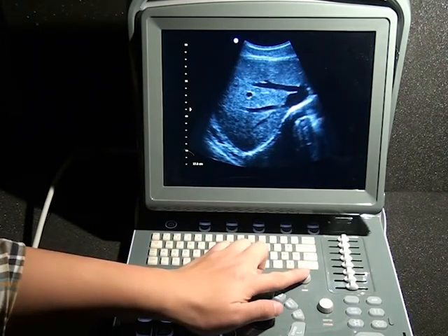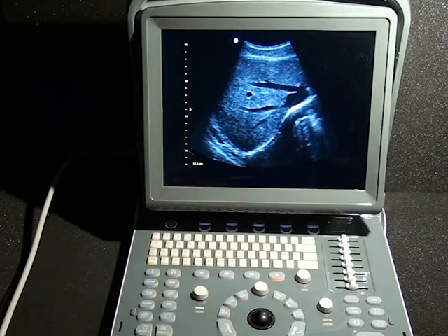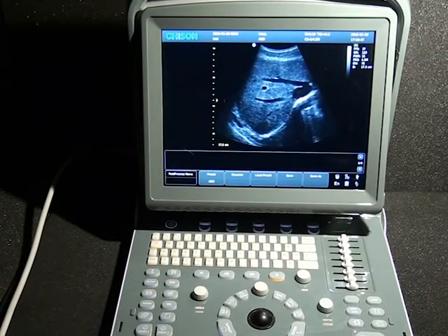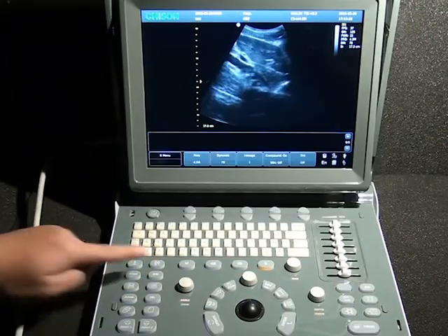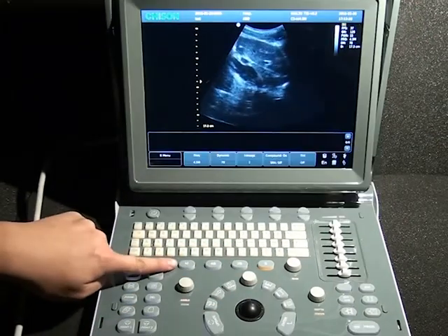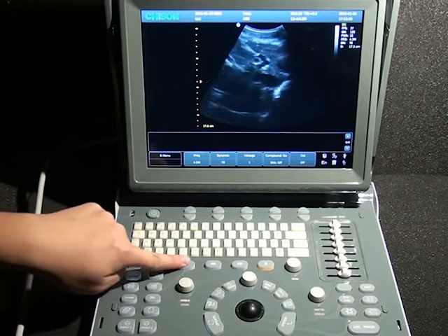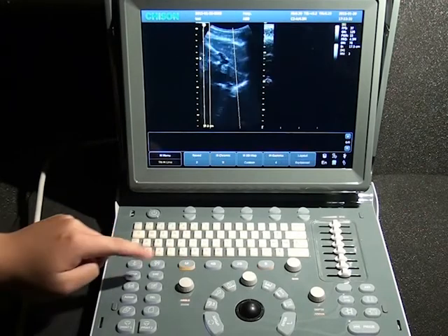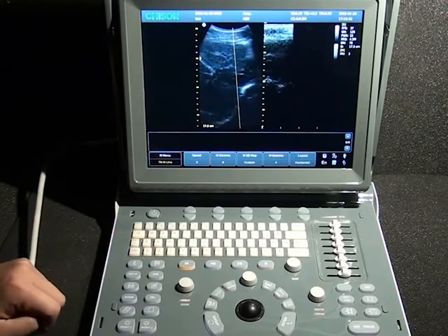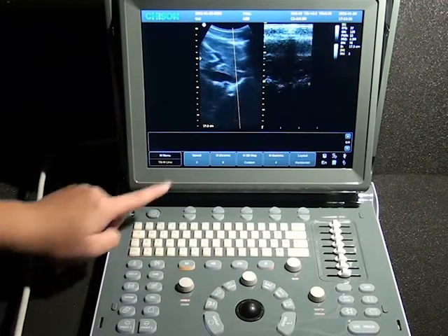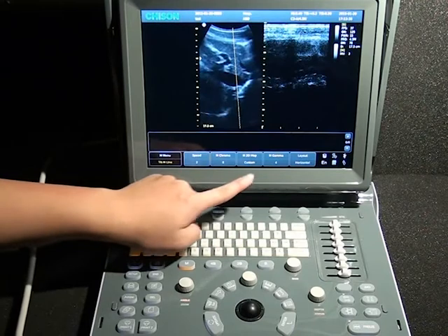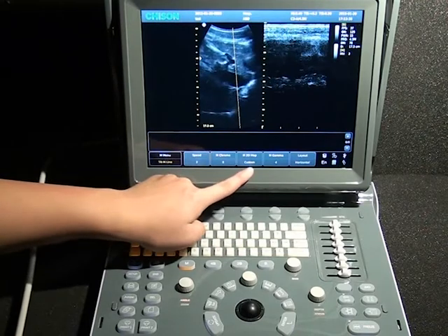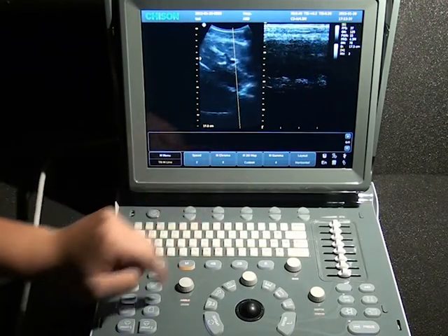Press the gain button to enlarge the image to full screen, and press again to go back. This is M-mode. When we use M-mode to scan the image, you can adjust speed and M2D map.